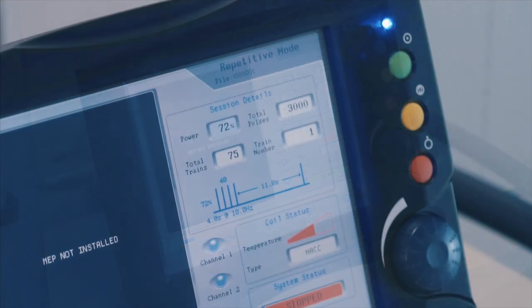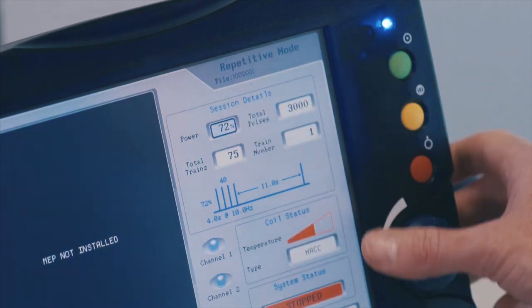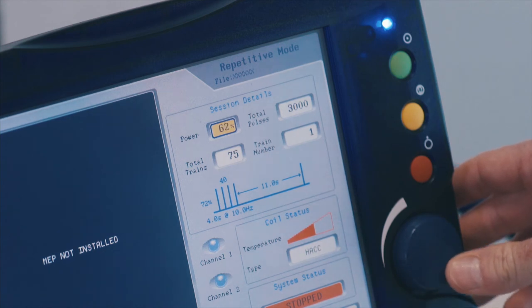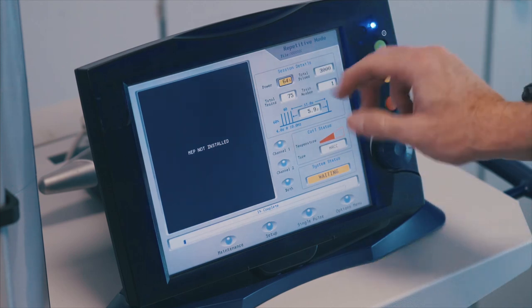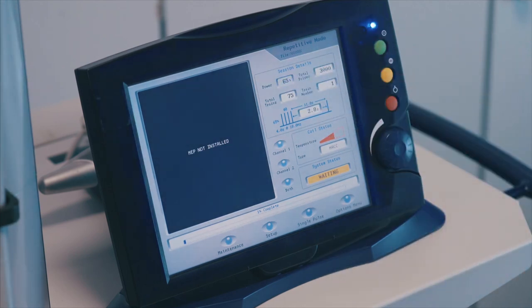To adjust the power during treatment, select the power window and use the control dial to adjust. Deselect the power window to confirm the change. The power window will turn orange to indicate the power is set to change and will return to normal once the treatment power is adjusted. You cannot adjust the power level above the %MT set when the treatment was set up.